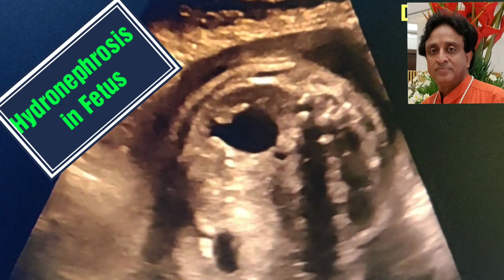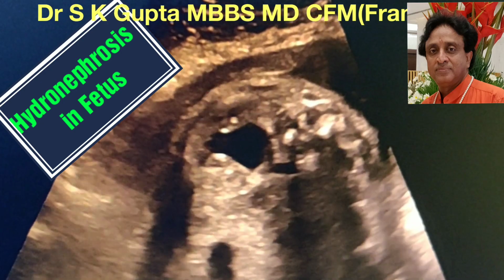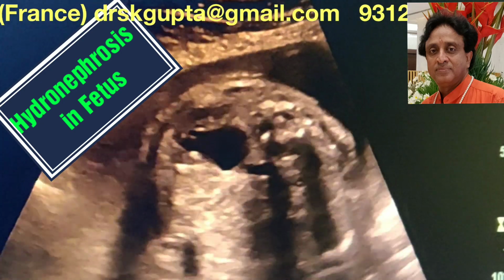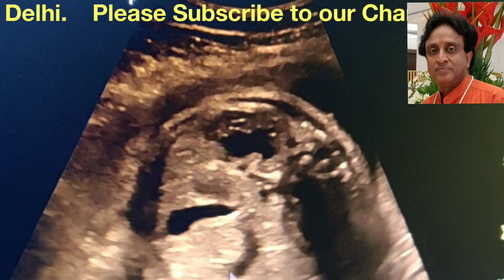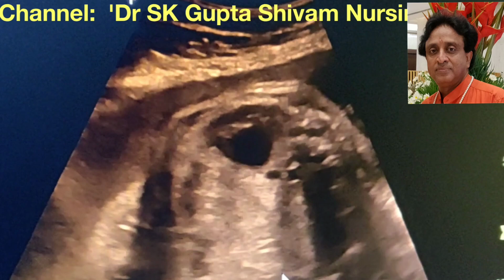Good day friends, today I am going to demonstrate to you unilateral hydronephrosis in the kidney of a fetus around 32 weeks of pregnancy. This is the axial scan of the abdomen of the fetus. I try to show you that this is the gallbladder. If you see, this is the gallbladder, this is the portal vein, and I try to focus the heart.